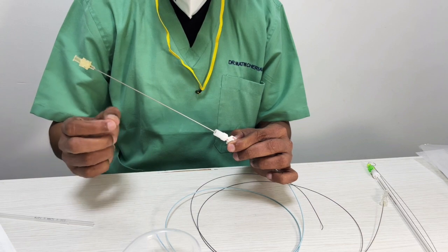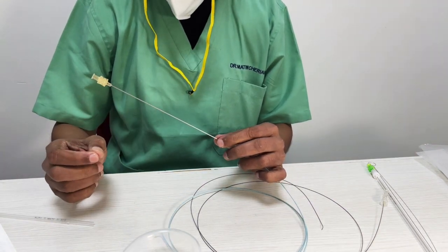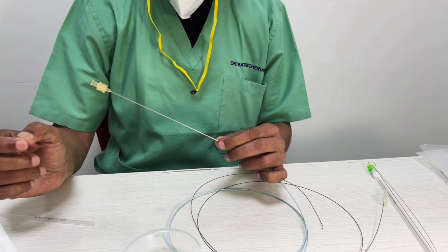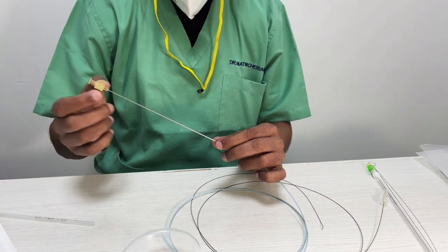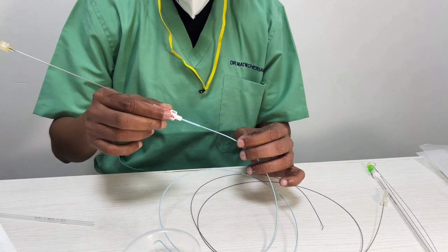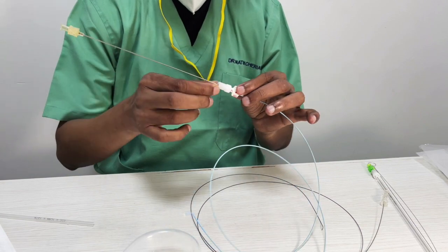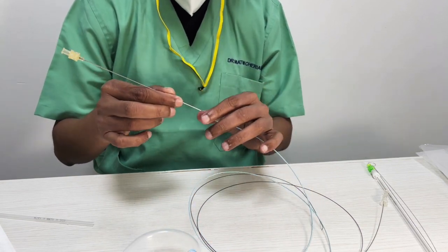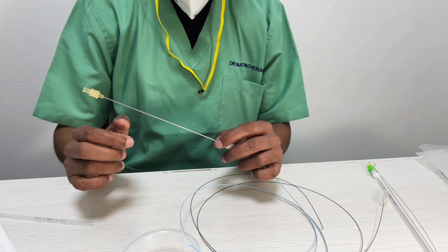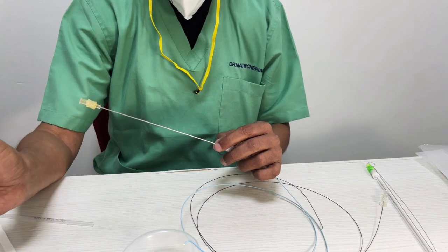So the next thing is pushing it out. Pushing out is done using a straight guide wire. Now, when the straight guide wire works like a pusher, it will allow the coil to get loaded into this. And because there is no dead space between this cylinder and the catheter, it will automatically get delivered into this catheter. So let's just get a straight guide wire.